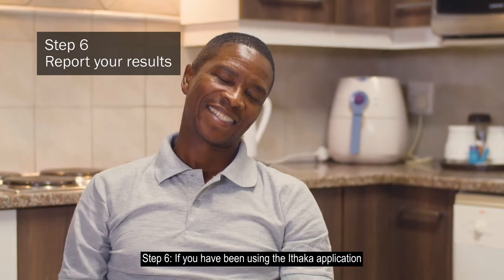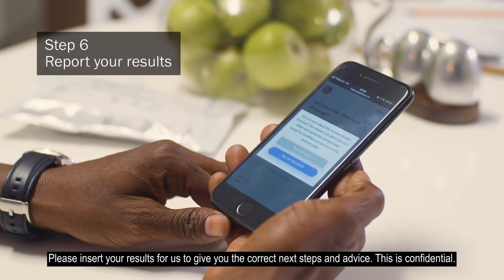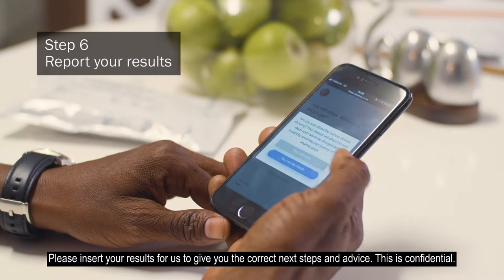Step 6: If you've been using the Ithaka application, please insert your results for us to give you the correct next steps and advice. This is confidential.